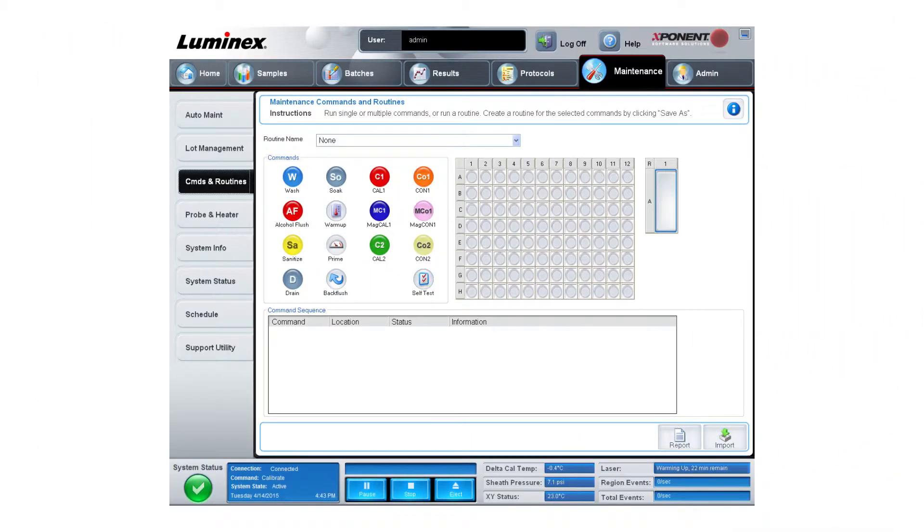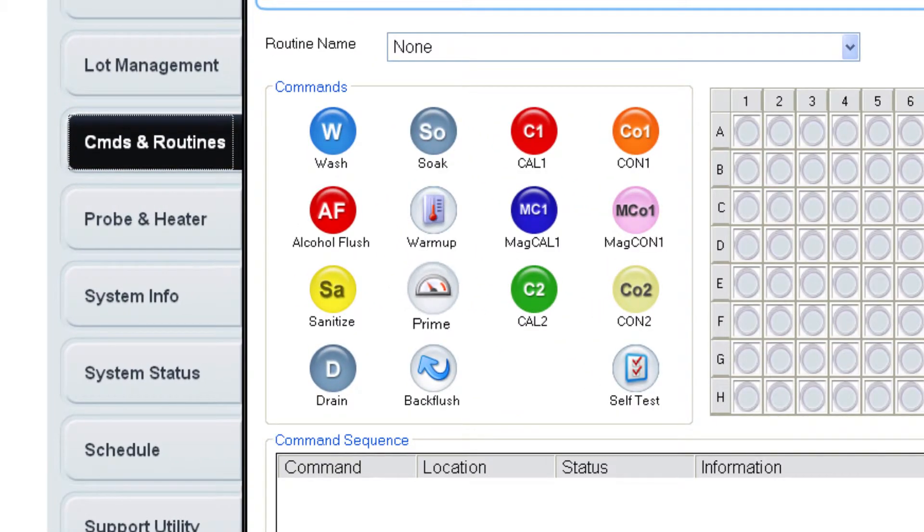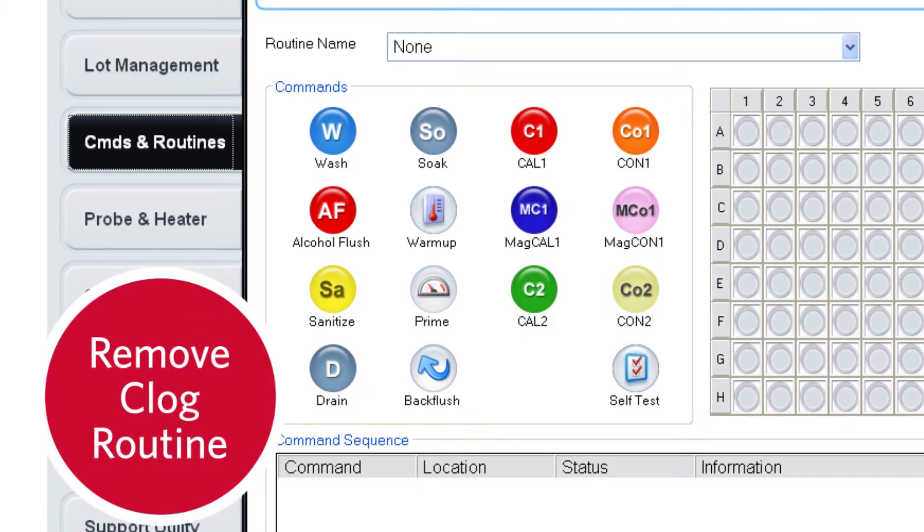In the Exponent software, run a prime. If the leak continues while the prime runs, perform a remove clog routine to break up any clogs within the sample tubing lines.